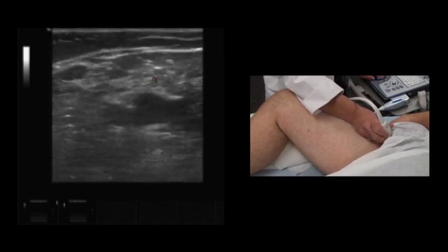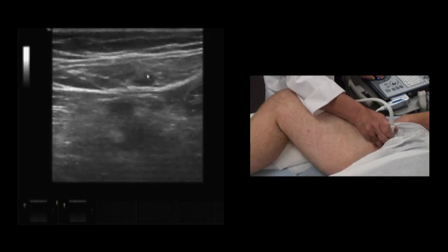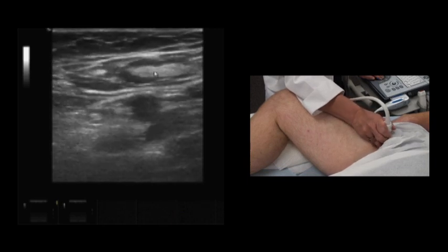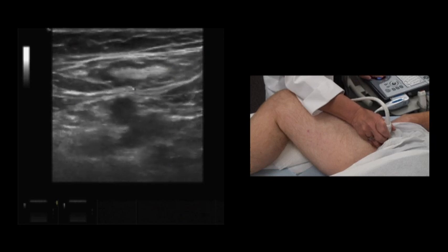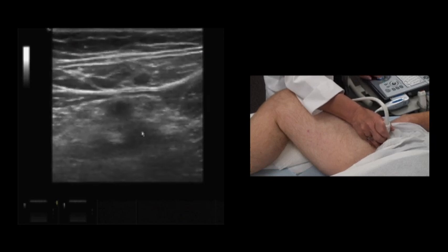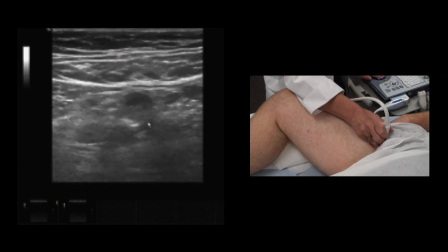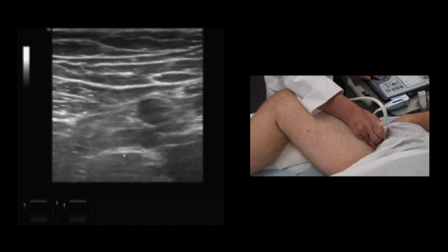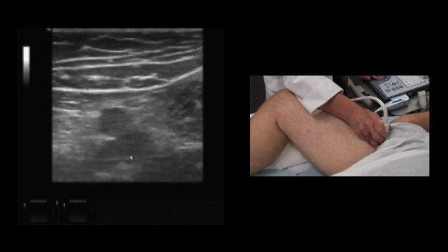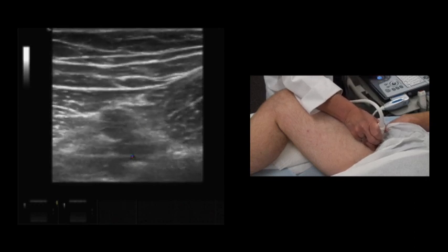Note, we just noticed a lymph node in the near field, and we always want to remark on the lymph node. This is our lymph node. We have the superficial femoral vein, profunda vein as the split, and then scanning inferiorly.